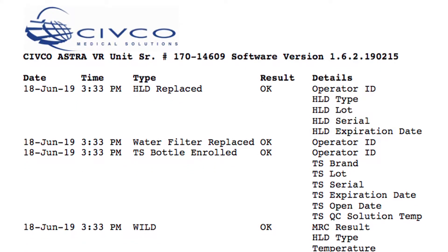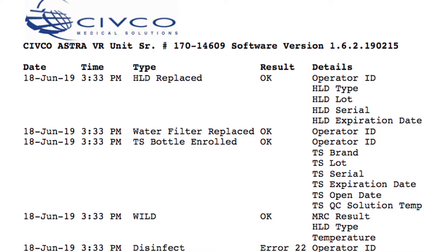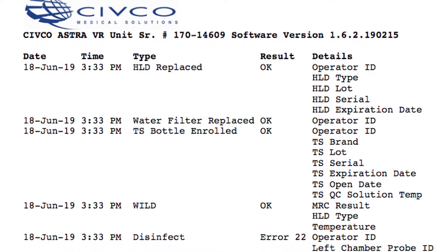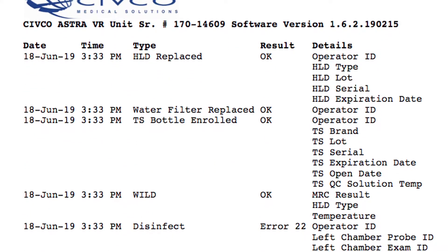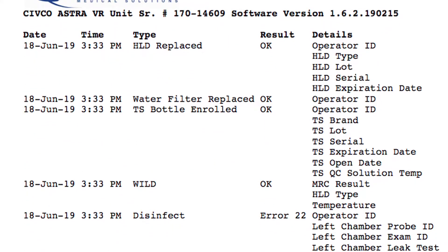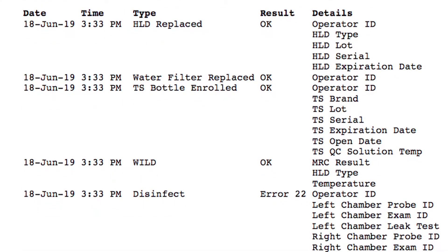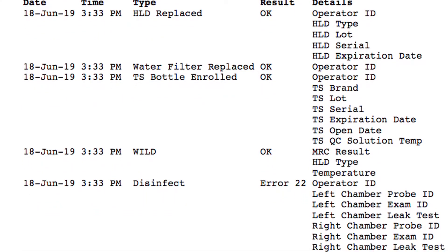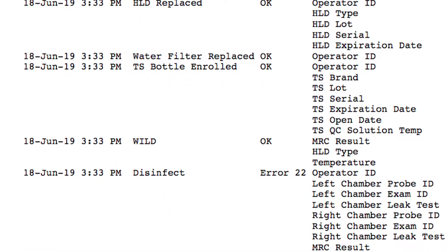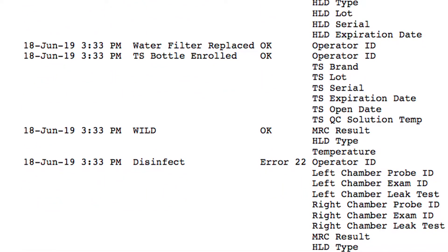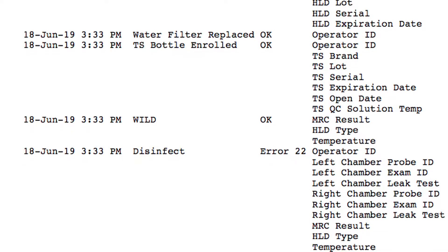You can download your cycle log at any time. Establish a regular pattern in accordance with your facility policy, such as weekly or every time you change the disinfectant bottle.